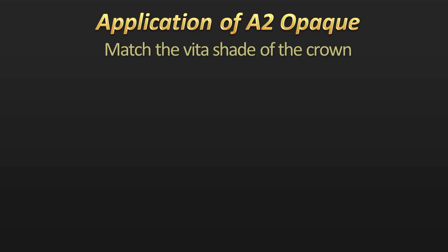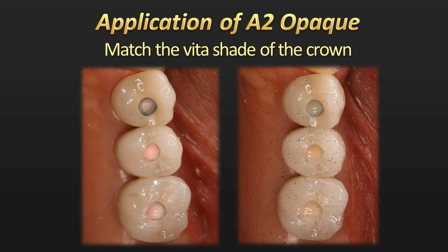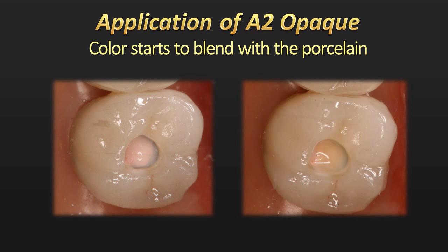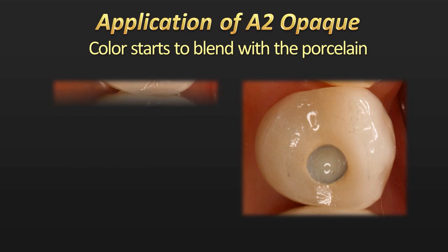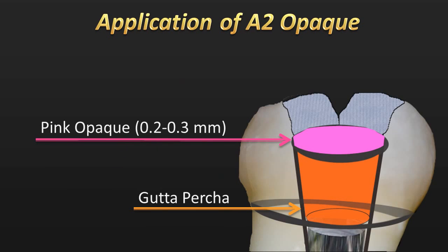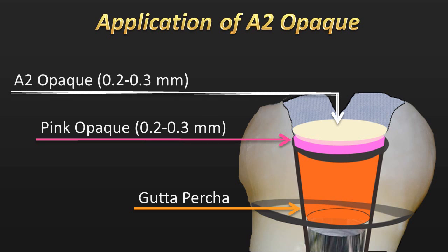The next material is the opaquer that matches the Vita shade of the crown. In this case, we have an A2 Vita shade crown, so we're using the A2–A2.5 opaquer from Cosmodent's Creative Color. We first opaque out the molar crown — you can see the color starting to blend with the surrounding porcelain. As we get to the bicuspid, we're still challenged; though we've gotten a little color influence, the value is still kind of low and looking a little dark. In the illustration, the A2 opaquer goes on top of the pink opaquer, again about two tenths of a millimeter thick over the gutta percha and over the metal rim, then light cured for 20 seconds.